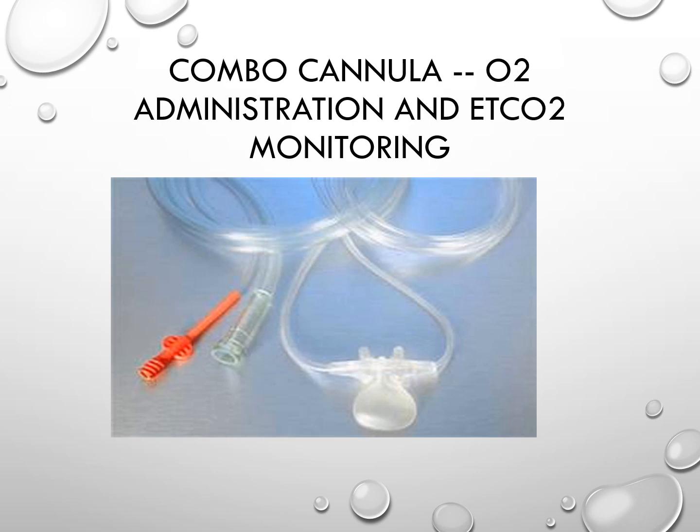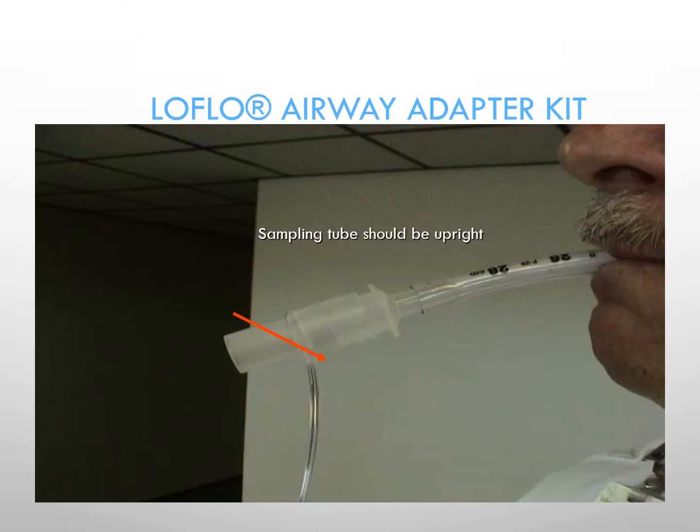So these devices can be useful, but they're not flawless. So the good news is we have end-tidal capnographic capabilities in many clinical settings. Certainly is the good news. The bad news is there's a lot of different systems that are used, and there's a lot of things that can affect their accuracy. A lot of factors.